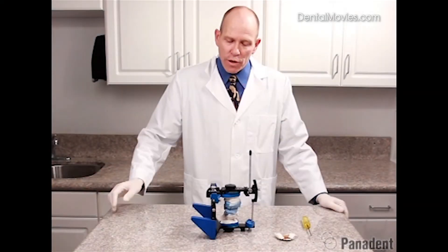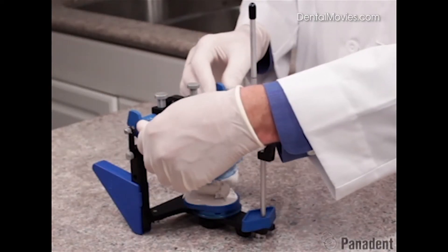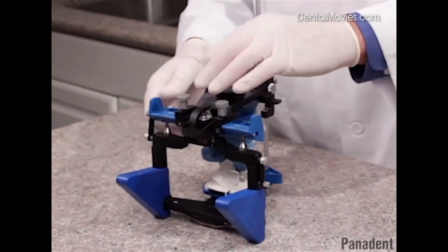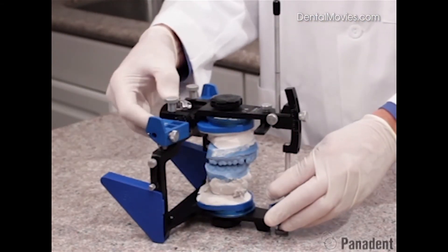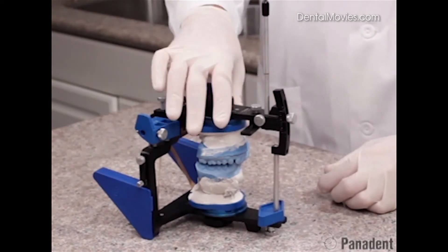We're now ready to set our condylar inclination using our protrusive check bite. In preparation for that, we do want to loosen the screw here on the analog so we can remove our Dynalink pin and put it in this little storage hole in the lower frame of the articulator. We can also release the centric latch and use the rubber band on the bottom of the articulator to help hold that latch out of our way.